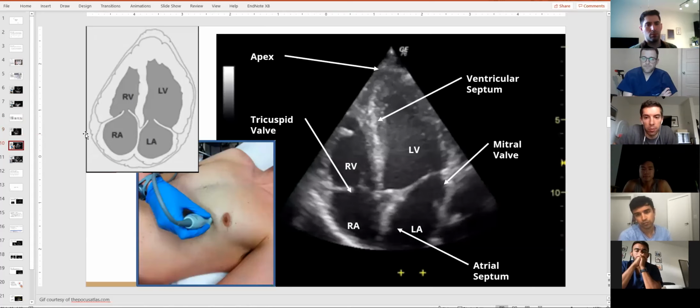And I'll just reiterate, before we go to apicals, what Spencer said before. Once you get to your parasternal short view and you have a good image, really the easiest way to get to the different levels of the heart is just by fanning the probe. Sometimes you do have to slide the probe. You guys know what we mean by those terms?